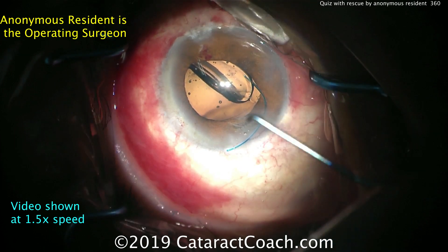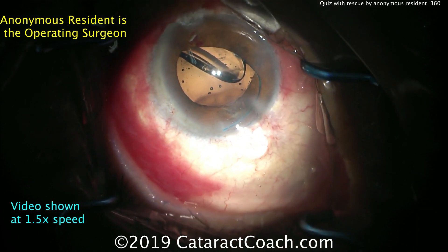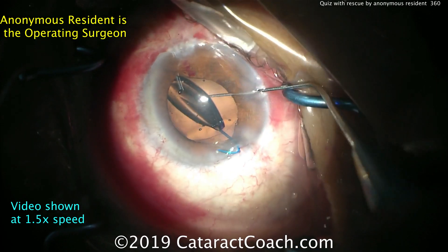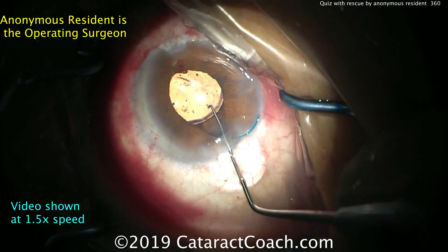Be careful here, because flipping this lens can stir up more vitreous, it can scrape the endothelium — there can be issues. The trailing haptic is incorrect; that's the letter S, and we all know S is stupid. Flipping it over — I like using the Sinskey hook through the side port; that's a nice maneuver.